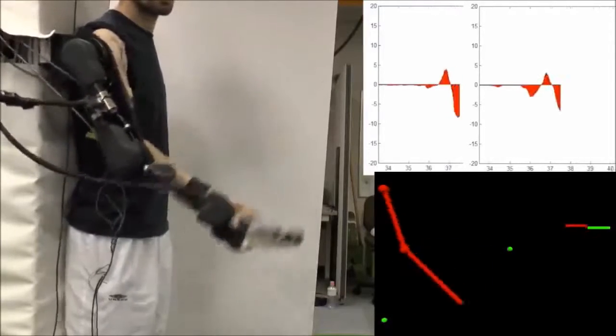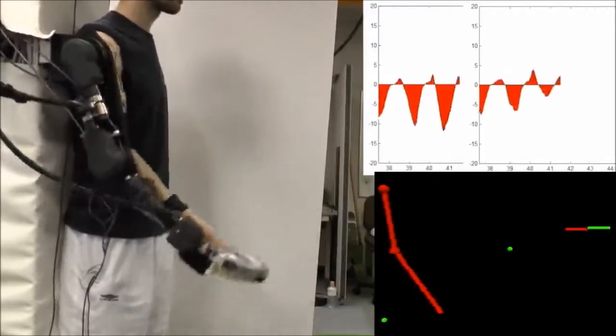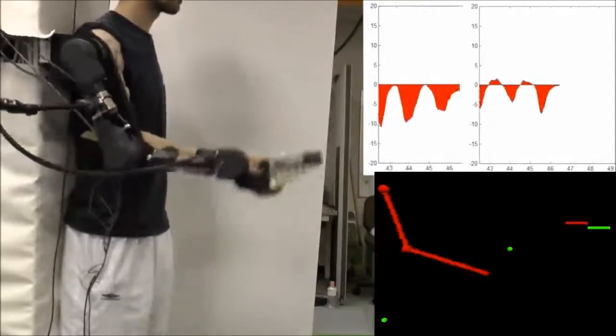To begin with, the subject initiated the desired motion by activating the appropriate muscles. The exoskeleton quickly adapted to the motion and minimized the subject's muscle activity.